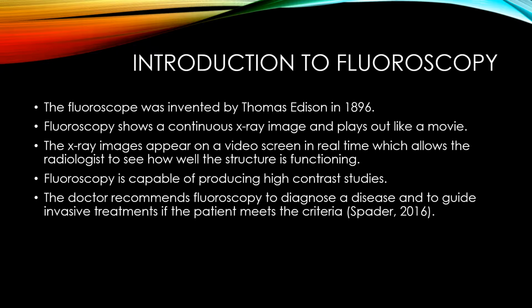Basically, fluoroscopy shows a continuous X-ray image and plays out like a movie. The X-ray images appear on a video screen in real time, which allows the radiologist to see how well the structure is functioning. Unlike conventional fluoroscopy, digital fluoroscopy has a more complex operating console and increased speed of image acquisition.